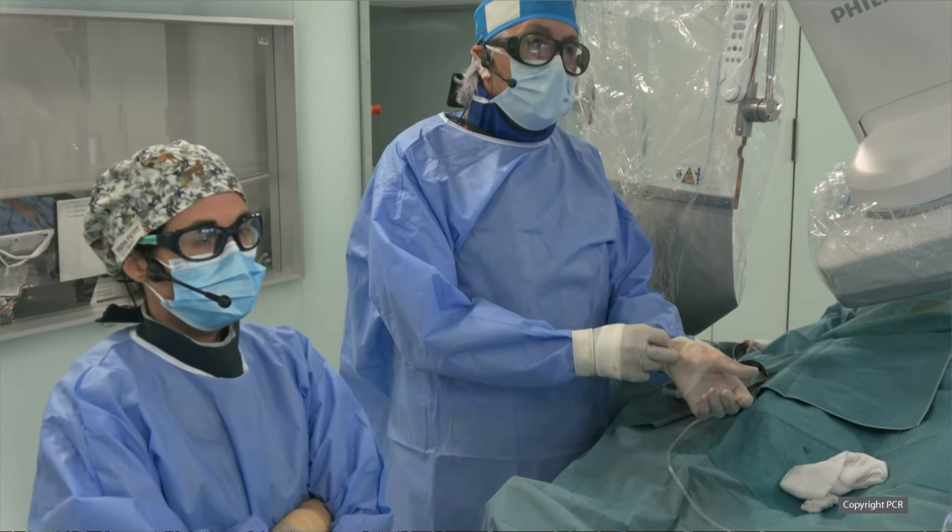It was a challenging case. This is something we expected, but I think that all in all, they did what they had in mind. That was their preconceived strategy. Of course, they will post-dilate, but the good take-home message was orbital atherectomy did it well, imaging was useful.